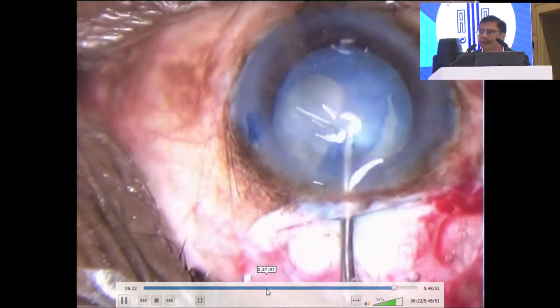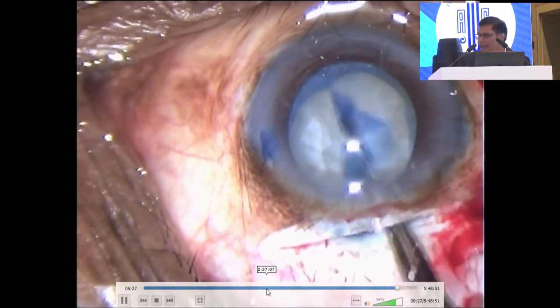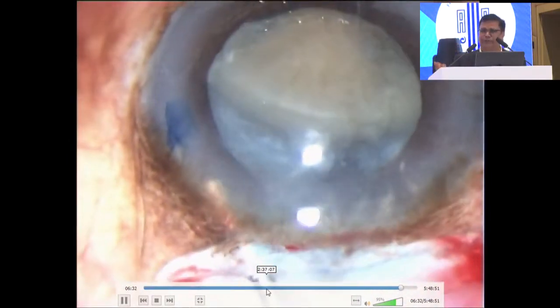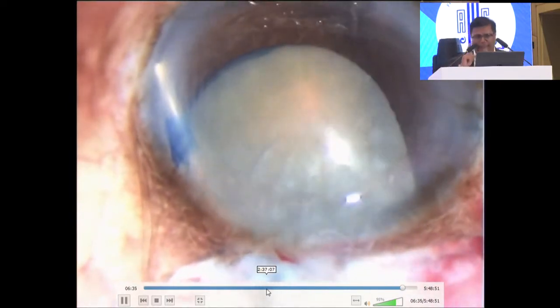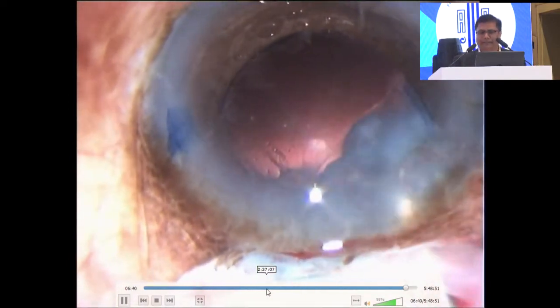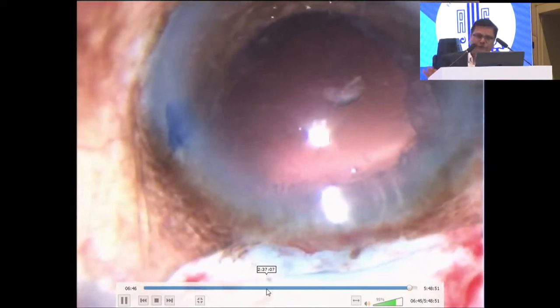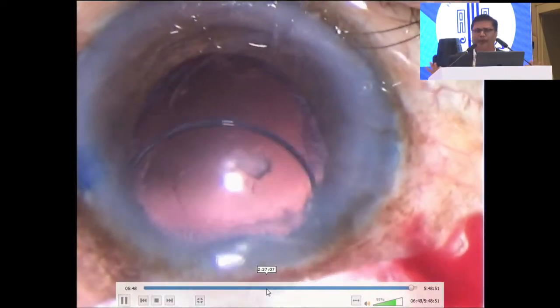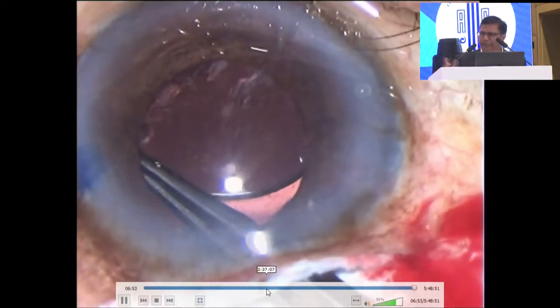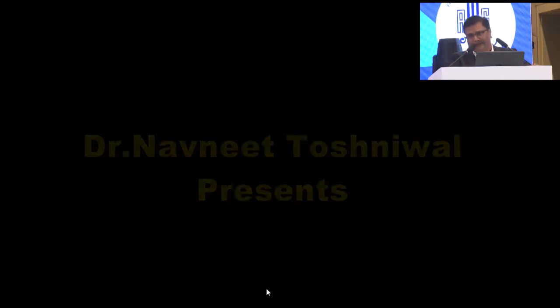Because this is what we have to keep in mind. Many doctors I have seen are excellent in phaco, but they don't have the great principles of SICS, but it is a must. SICS is a more important surgery, as the sir has also mentioned. You cannot leave the case like that; you convert the case, and then you can put the lens. My choice of lens is a 3-piece PMMA IOL. That gives excellent results, there is no pressure on the zonules. It is more flexible, and this is the way you can manage things.